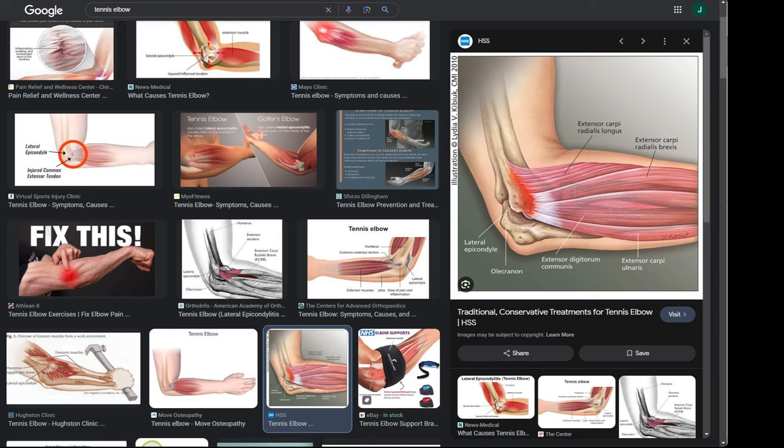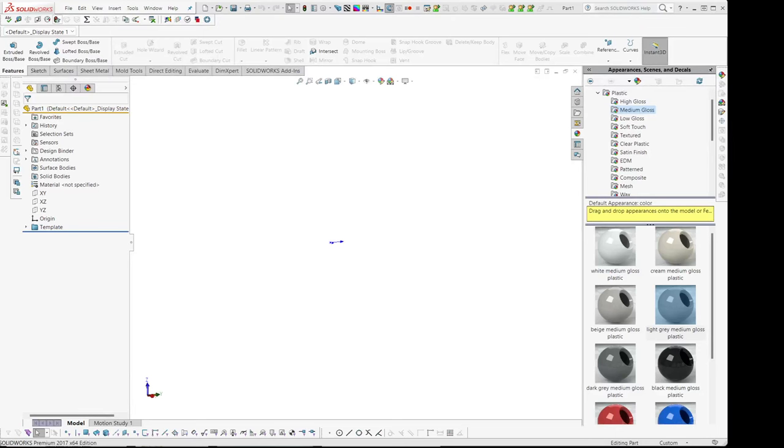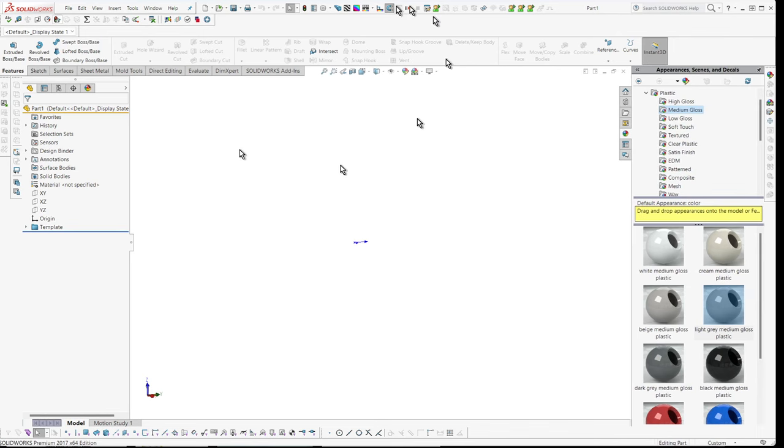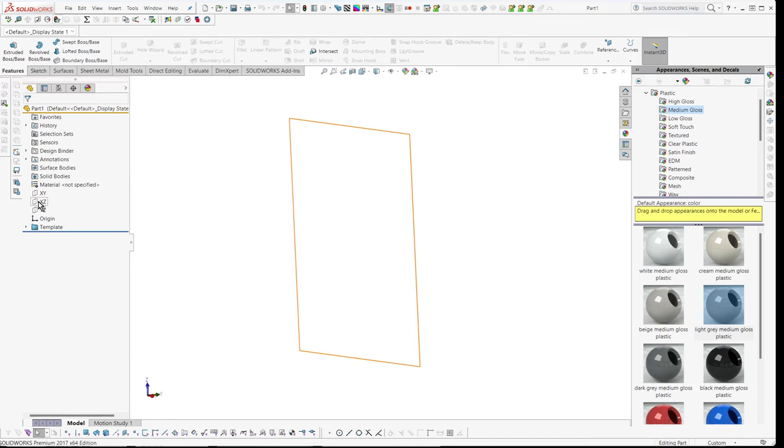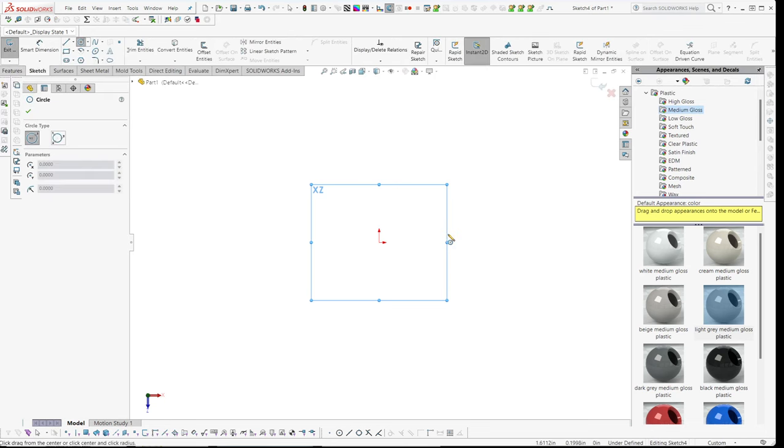I'm going to design this in SolidWorks. I have a new SolidWorks document open here at 1080p. It's a little smaller than I'm used to so I might not be able to see some buttons — no big deal. I'll turn off origin visibility. Basically I'm going to mimic the shape of a cantaloupe and optimize for 3D printing. Let's go to the front view — the XZ view — and start a sketch. I'll type C for circle, which is my usual shortcut, and press centerline.